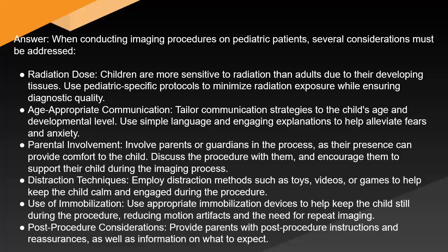Distraction techniques: employ distraction methods such as toys, videos, or games to help keep the child calm and engaged during the procedure. Use of immobilization: use appropriate immobilization devices to help keep the child still during the procedure, reducing motion artifacts and the need for repeat imaging. Post-procedure considerations: provide parents with post-procedure instructions and reassurances, as well as information on what to expect.